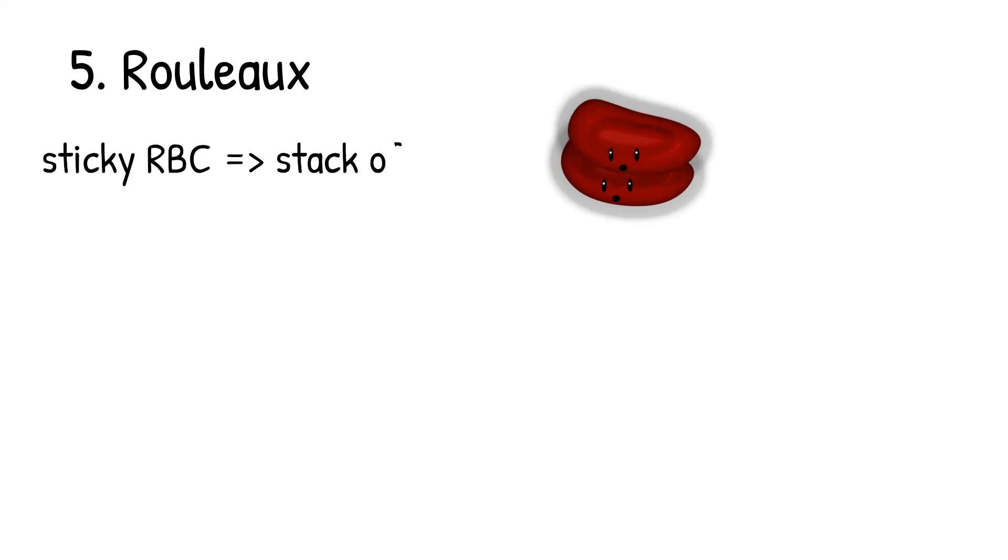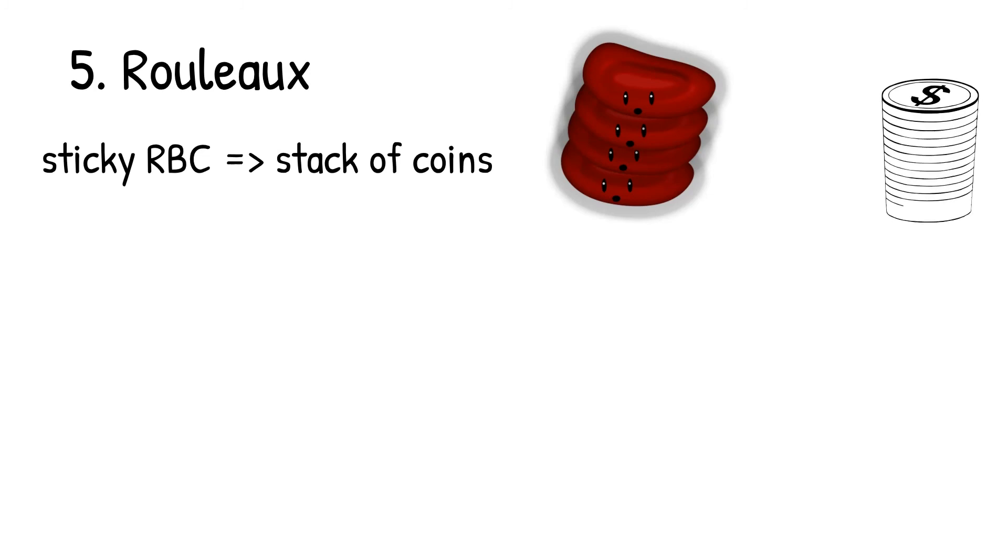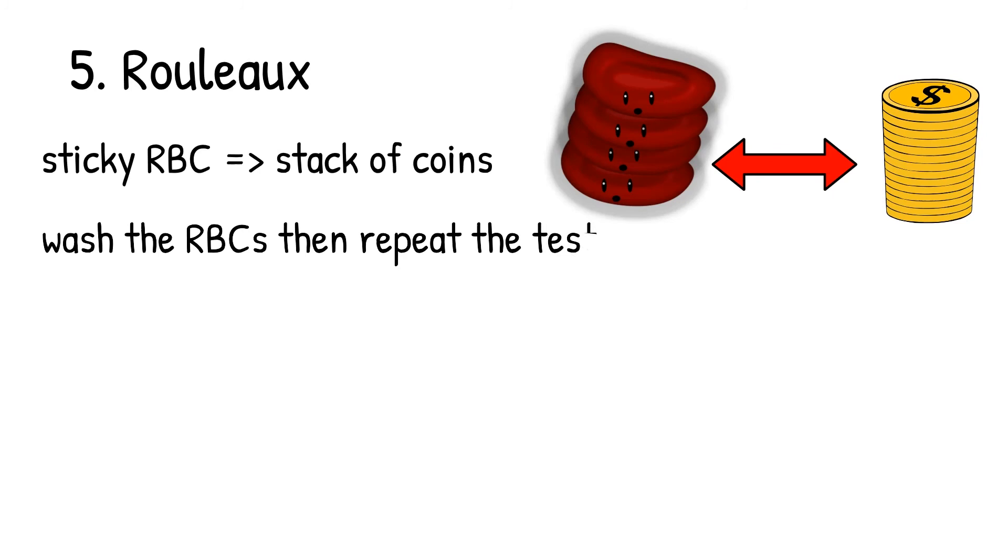Fifth, rouleaux. Rouleaux is a condition that makes the red blood cells become very sticky because the extra protein in the serums. The red blood cells stick to each other in a stack like often referred to as a stack of coins. To solve these problems, wash the red blood cells, then repeat the test.